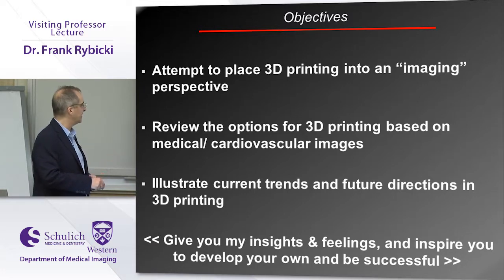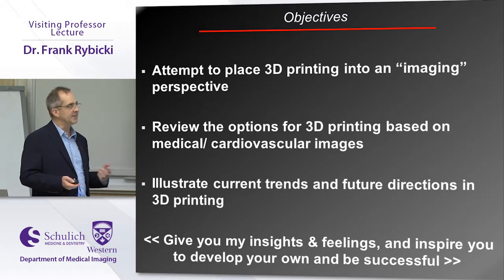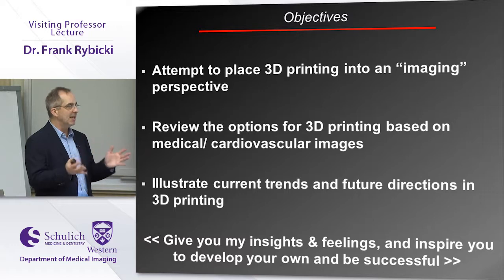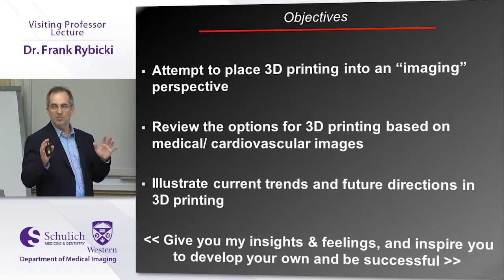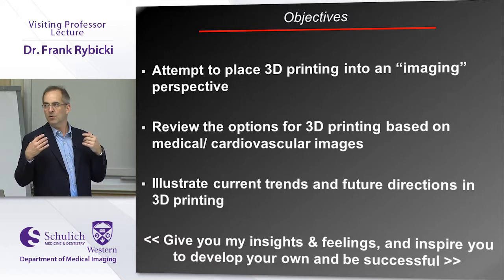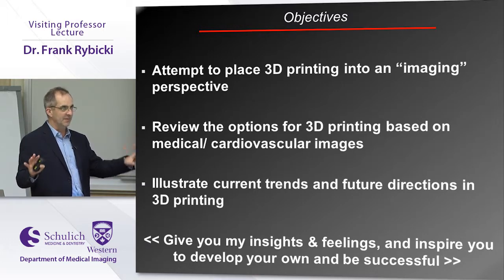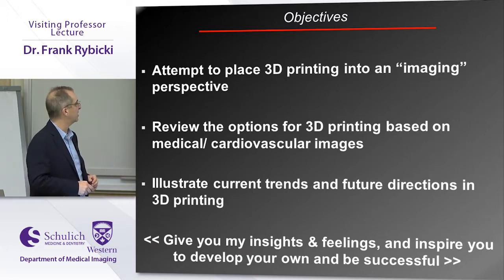I'll go through some of these other things and mostly just give you my insights and feelings on the field. And if you like 3D visualization or reformatted types of imaging, or if you like things like advanced cardiac imaging where there's a lot of reformatting, a lot of vascular stuff, a lot of abdominal things, there's a lot of 3D visualization. So just for definition, volume rendering, MIPs, all of that stuff, everything that you do on a radiology workstation is now called 3D visualization. Anything that you do to create a physical model or to actually create a non-DICOM image, whether you do that through a virtual reality tool, whether you 3D print it, or you do a combined virtual reality 3D printing thing, that's all in the field of 3D printing. So that's the separation between 3D visualization, that terminology, and 3D printing, just so you know.